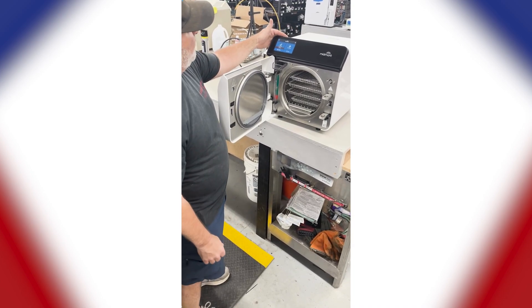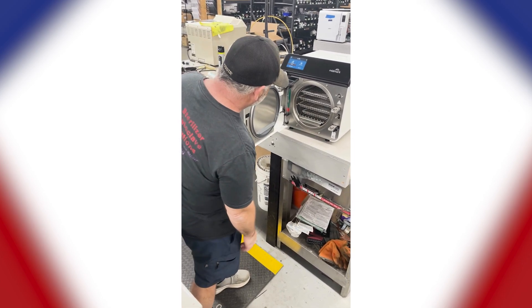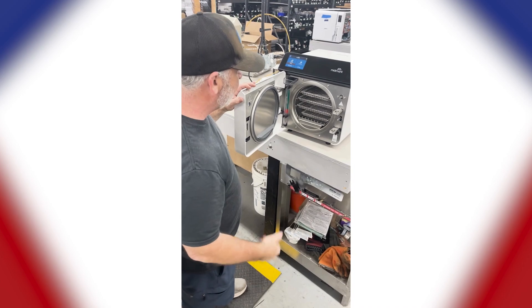For your routine care, it will give you weekly reminders — things such as changing your water every week, which I like. They did make improvements as well. It will tell you when it's time to add water.